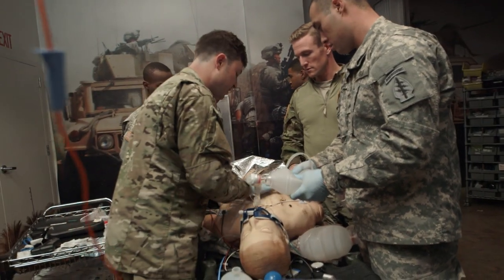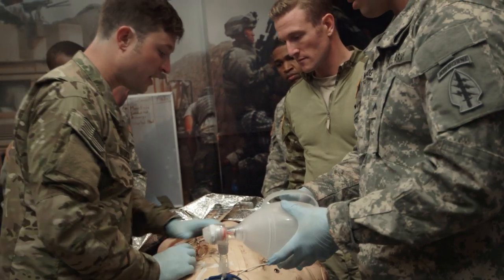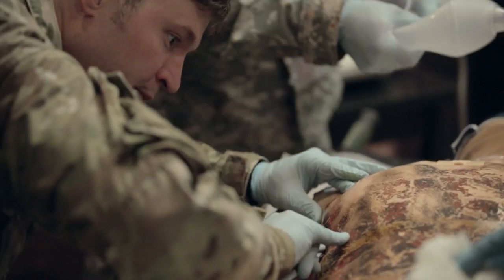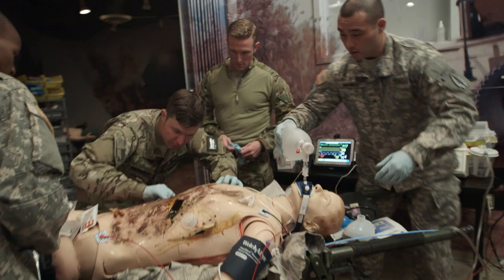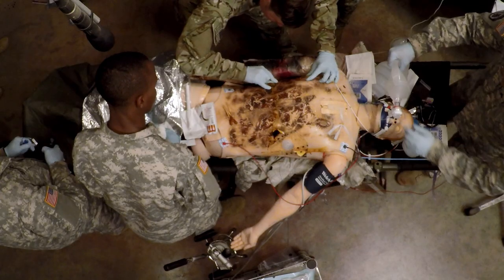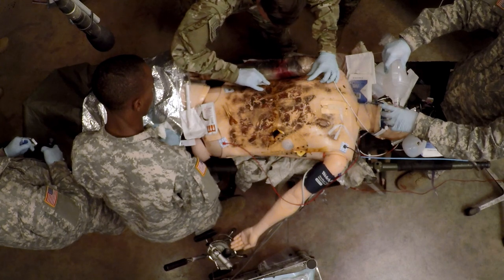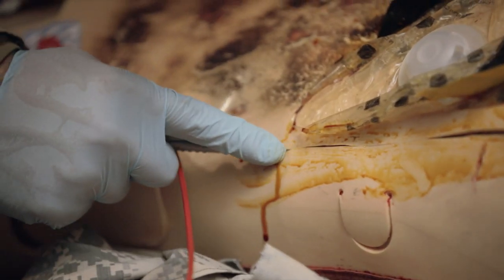He feels really tense in his chest. So explain to me how you're going to do that. Going to clean the area with betadine, then we're going to go with a scalpel and cut along the anterior axillary line from just below the clavicle all the way down to the costal margins and see if that affects his breathing. Do that bilaterally. If his breathing gets better, we're going to roll with that, but we might have to go one across the diaphragm.